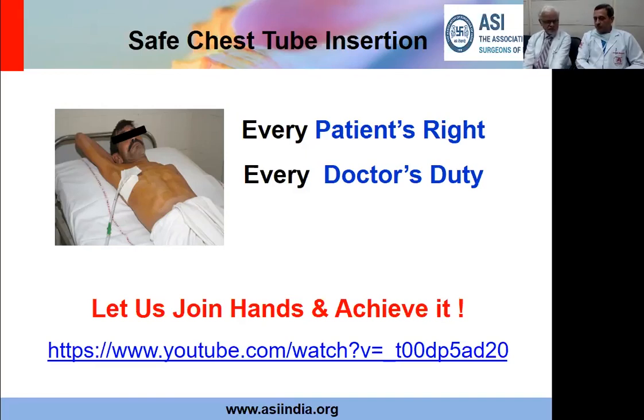One of the complications which can be very unnerving to a young doctor is bleeding from an intercostal vessel. So if that were to happen, what would be your advice to such a doctor and how to manage it? Yeah, so best is to avoid these complications by just paying attention to basic steps. If you palpate the ribs and the intercostal space and site your cut and your entry puncture at the upper margin of the lower rib rather than at the lower margin of the upper rib, which is where the neurovascular bundle is running, I think you would avoid inadvertent injury to this.